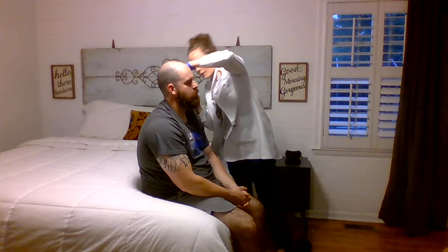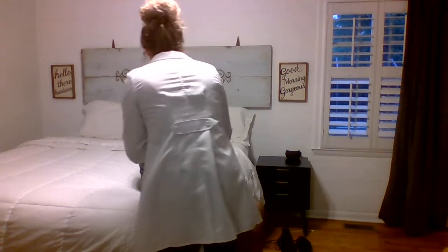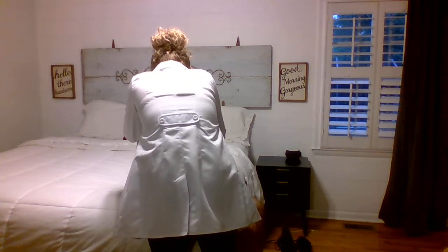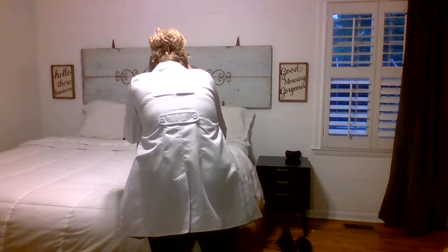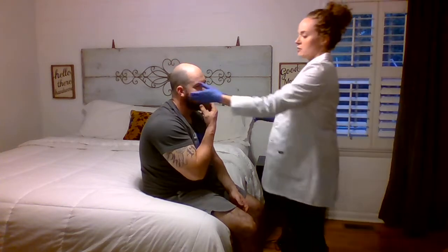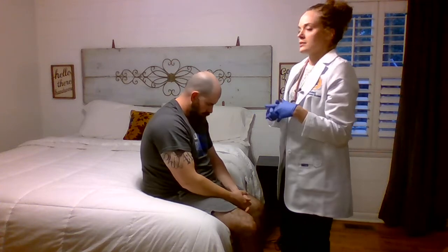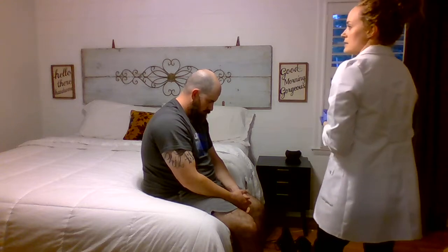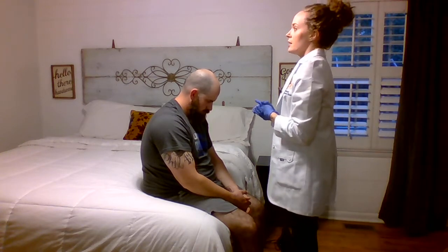All right. Got quite a bit of cerumen buildup there in that ear. Even more in that ear. Do you have any difficulties hearing in that ear? No? It's kind of hard to visualize his tympanic membrane on this side because he has so much cerumen buildup. So we may need to discuss this impacting that. Alright, so otherwise his ears look great.